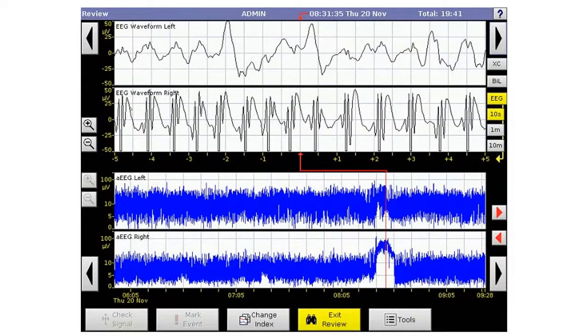Okay, so let's talk about what are these features of seizures on aEEG. What we're looking for is the archway, a kind of rounded arch in there. So we want an archway. This is a beginning, a middle, and an end, a crescendo, decrescendo of our aEEG band.